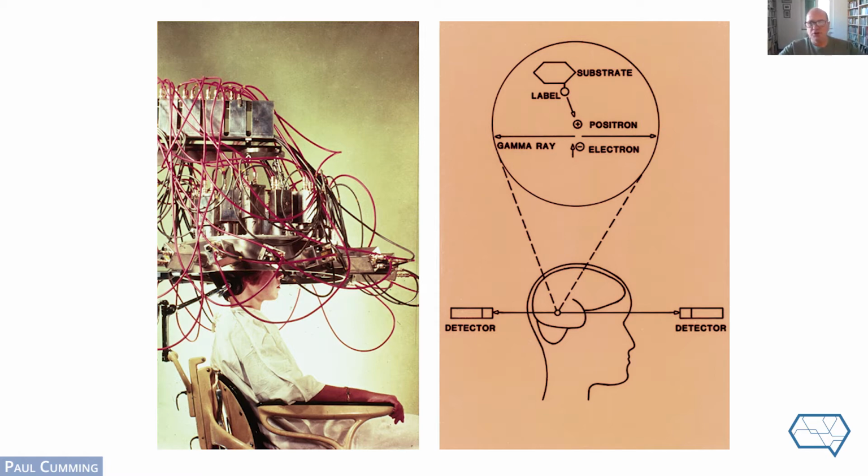And if they encounter two detectors separated across this ring, which would take some luck because these are relatively small detectors in that prototype scanner. But if it does happen that two events are registered by the detectors on either side of the ring in the same instant, that counts as a decay event. And that registers towards eventually producing an image. Next slide.